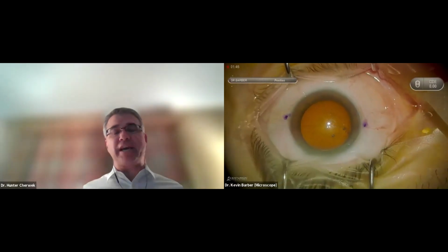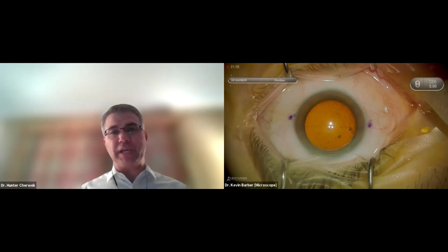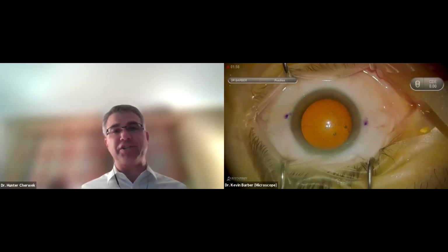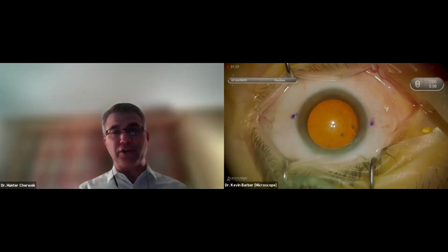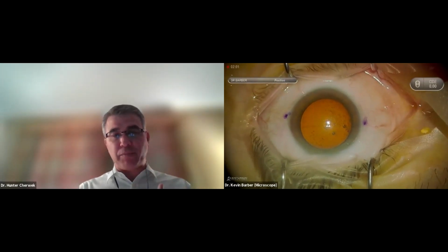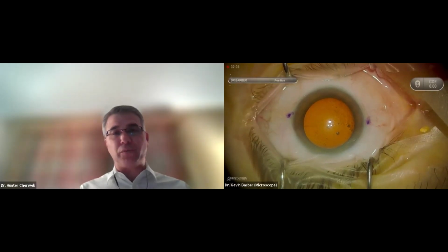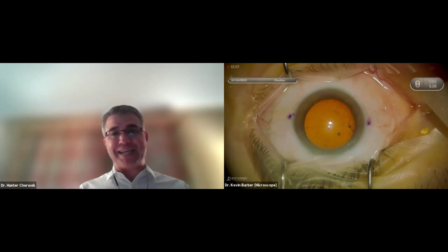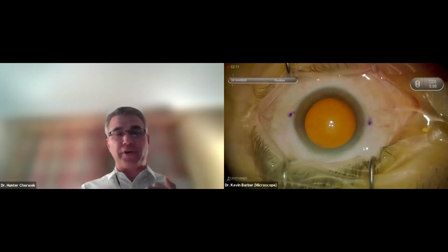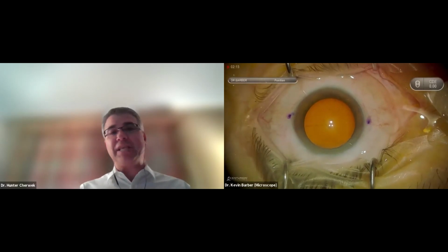These lenses really have revolutionized refractive outcomes, where patients now perceive cataract surgery as a refractive procedure, not just a sight restoring procedure. So, in the case coming up, you'll see that Kevin has already marked the patient, and this is different from his normal practice where he uses the digital markers and some of the advanced technology for visualization. But he's still doing the same pathway with regards to measurements, pre-op counseling, and patient discussions. And for me, that's critical.